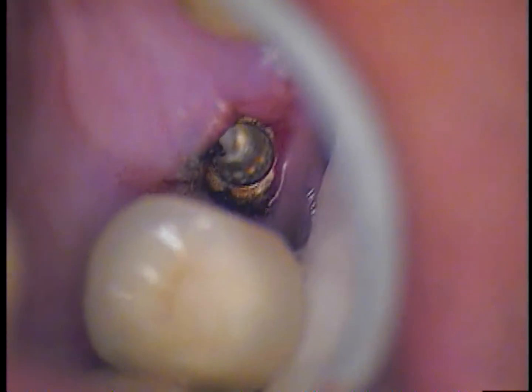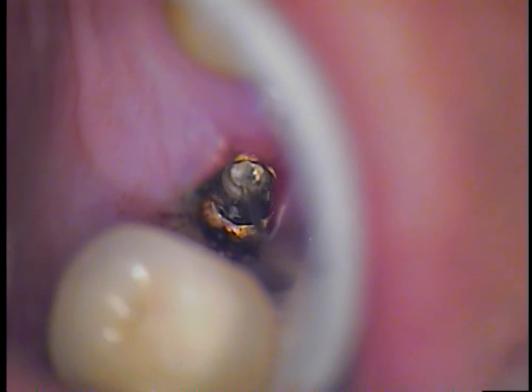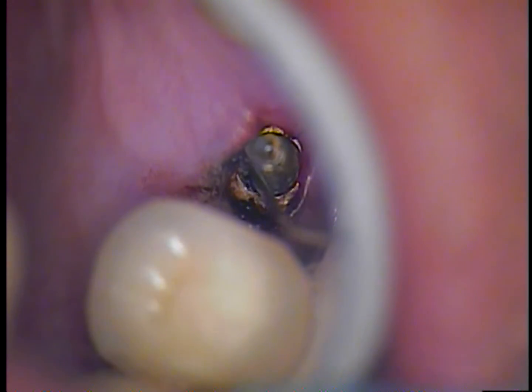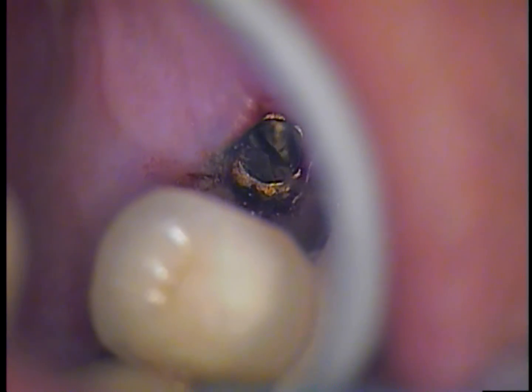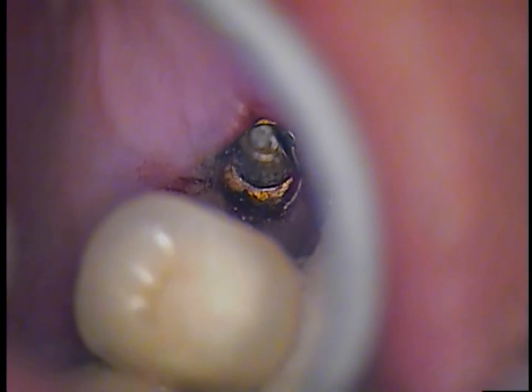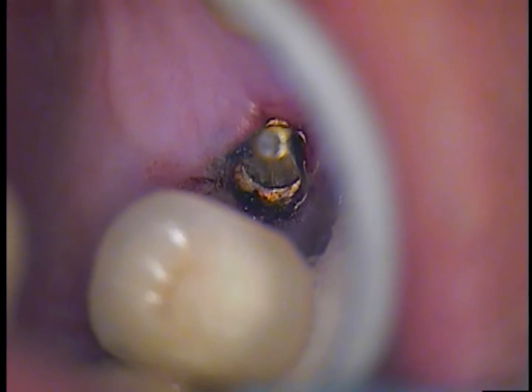What you will see is a clockwise rotation on the video, which means I am doing a counterclockwise rotation in the mouth. So just a very gentle test — here we go. The patient is now informed that we have got a loose screw and the fragment is loose. He does not have to go through having the implant trephined and removed and going through unnecessary surgery to have a new implant placed.